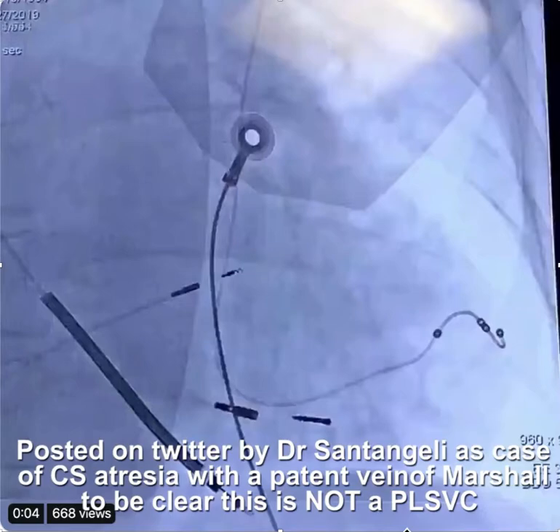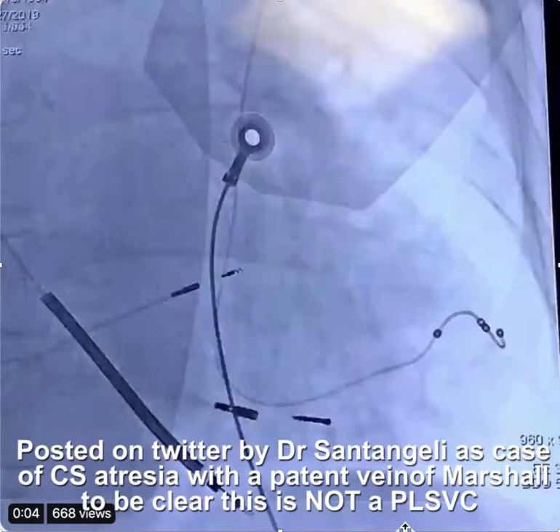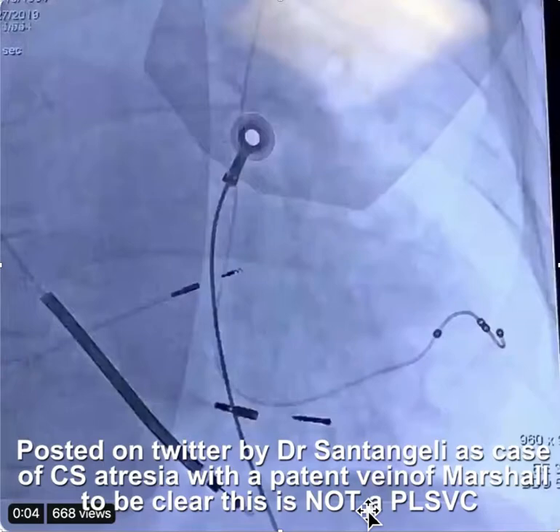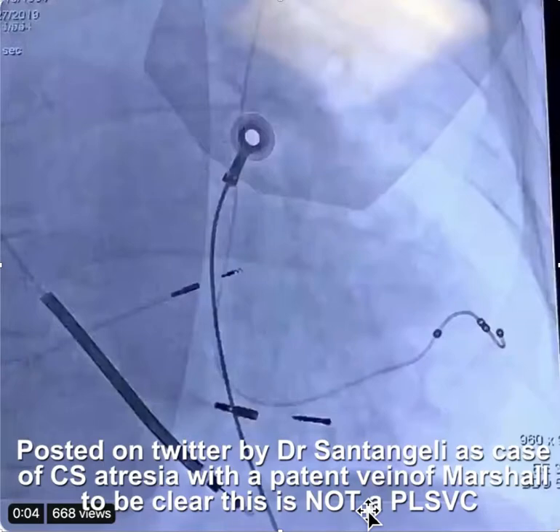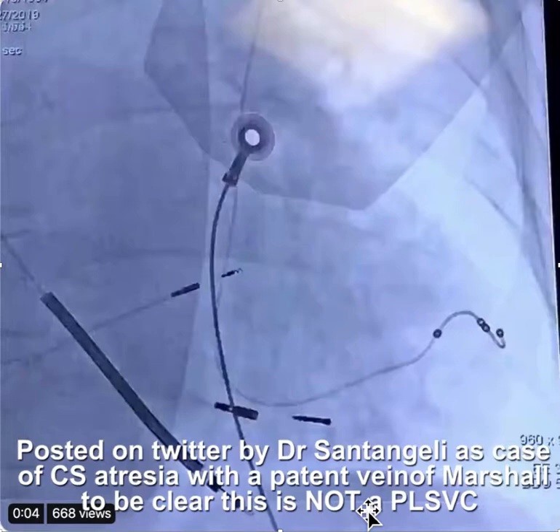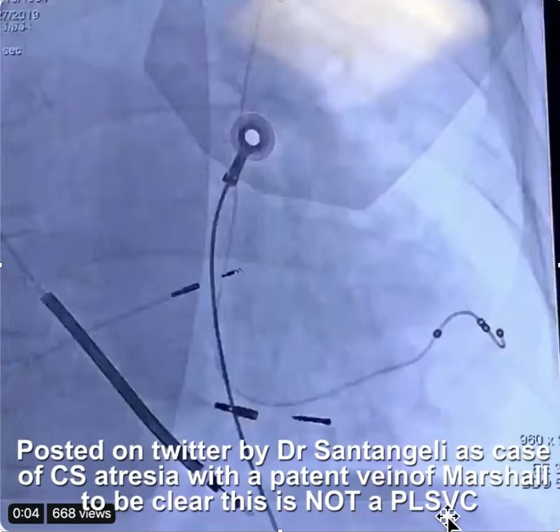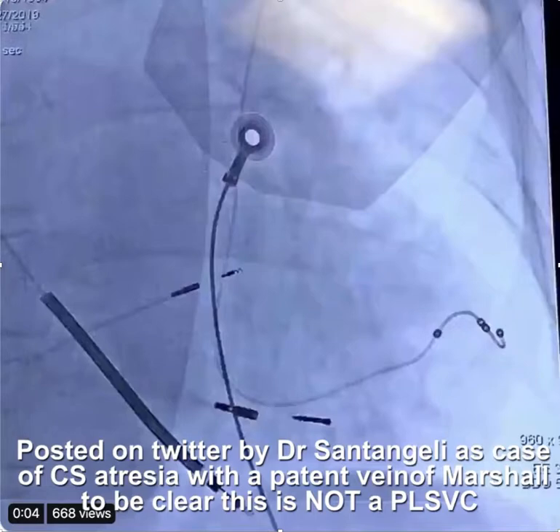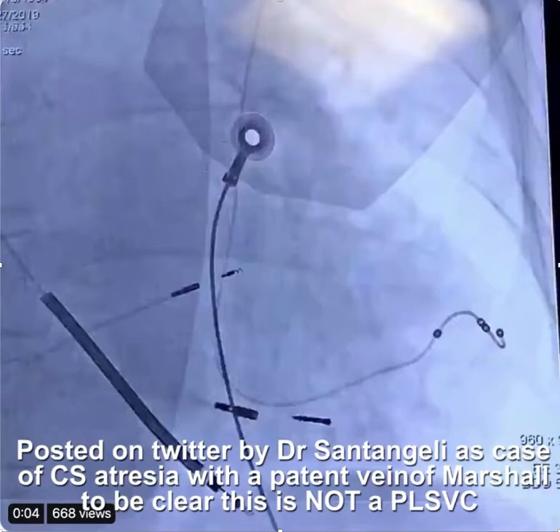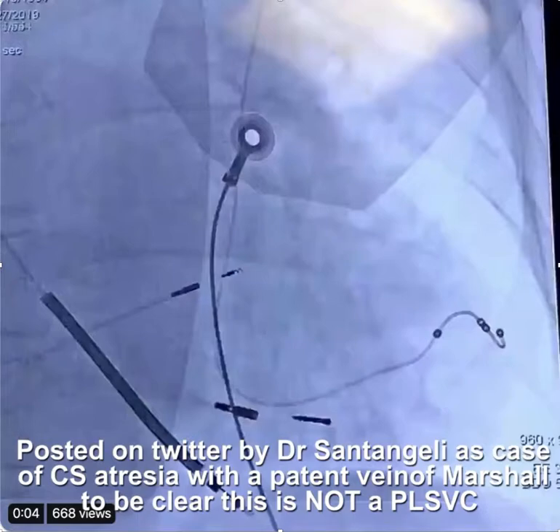This is a case posted on Twitter by Dr. Santangeli from the University of Pennsylvania as a case of CS atresia in a patient with a patent vein of Marshall. To be clear, this is CS atresia with a patent vein of Marshall and not a persistent left SVC. This was a previously failed implant, and because he had become aware of a patent vein of Marshall, he was able to successfully implant.